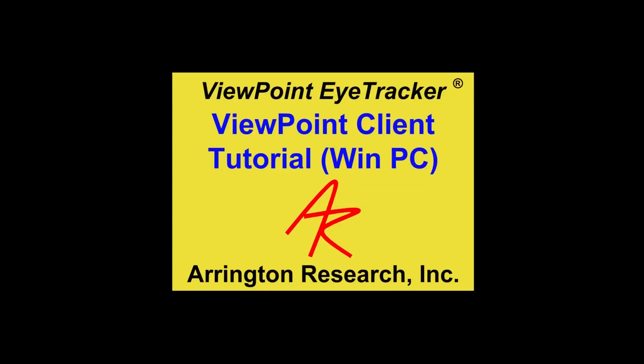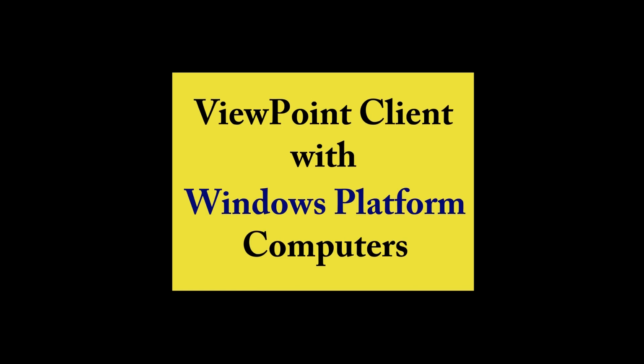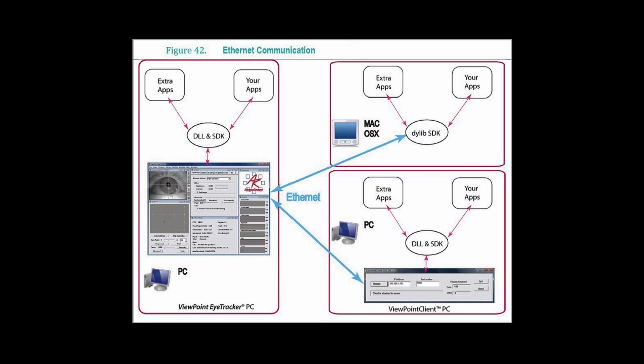This is a tutorial on the ViewPoint client. Here are the directions on running ViewPoint client on a Microsoft Windows computer. The ViewPoint eye tracker can communicate with other computers via Ethernet. The ViewPoint eye tracker has an Ethernet server built into it.